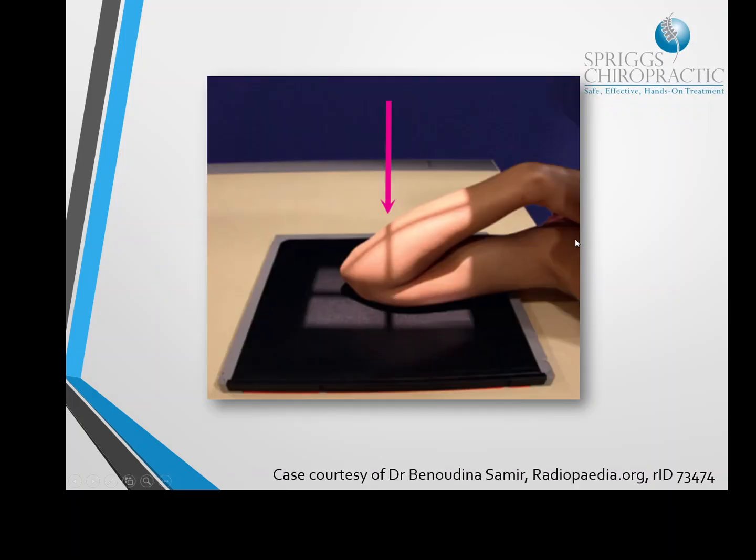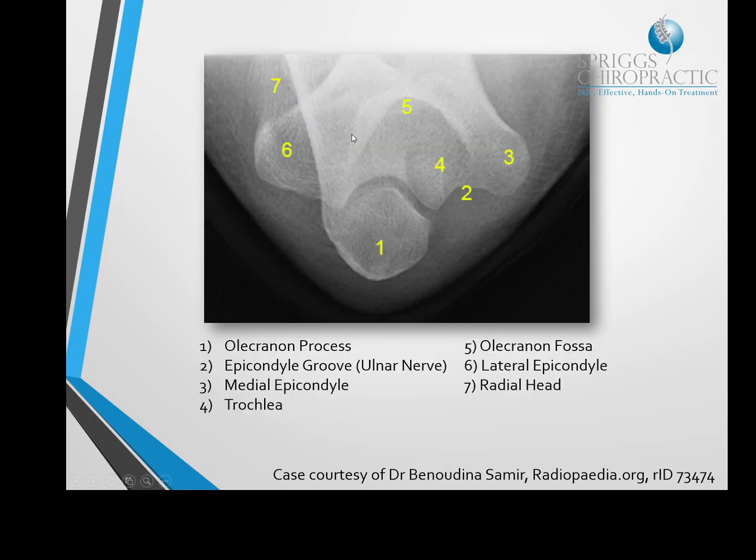So this is how you set the patient up again. Just so in this particular setting, obviously we've got the cassette underneath the patient's elbow. They're obviously in a seated position, and if they can, we flex the elbow as far as possible. Central ray is probably going to be a little bit more over here, but this is a nice generous view for us to be able to see as much of the anatomy as possible. And this is what it will look like.